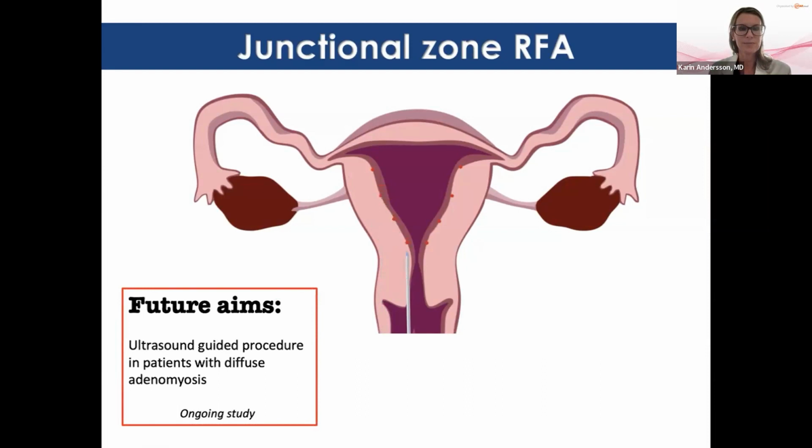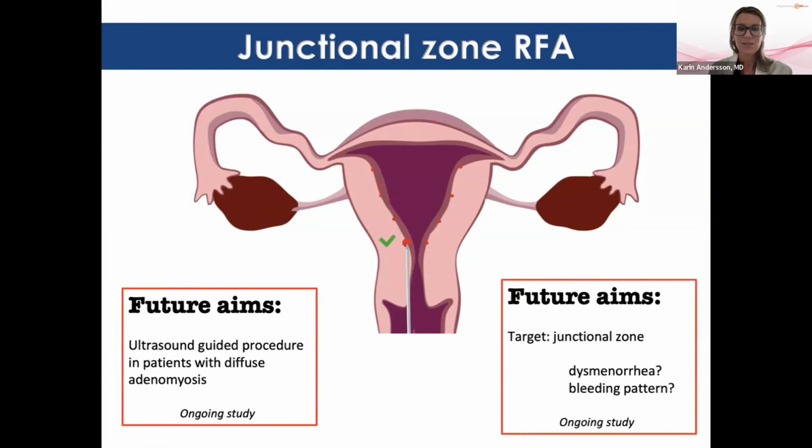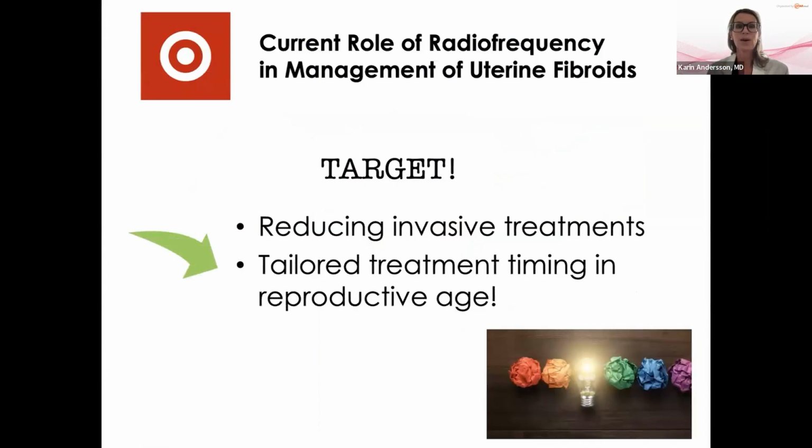This is our ongoing study that we are thinking about, hoping to reduce the dysmenorrhea and the bleeding pattern in patients that have adenomyosis, the diffuse adenomyosis. So the target is to reduce the invasive treatments in general with this radiofrequency ablation strategy, and to provide a tailored treatment and timing in reproductive age. This is what we aim for.